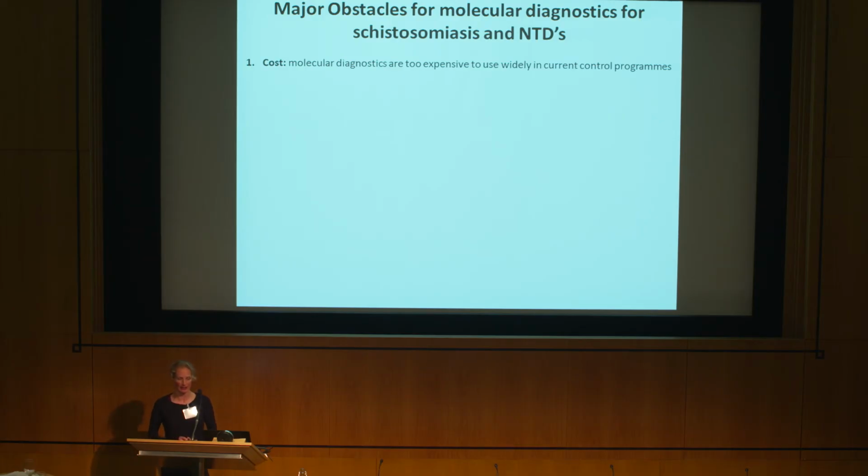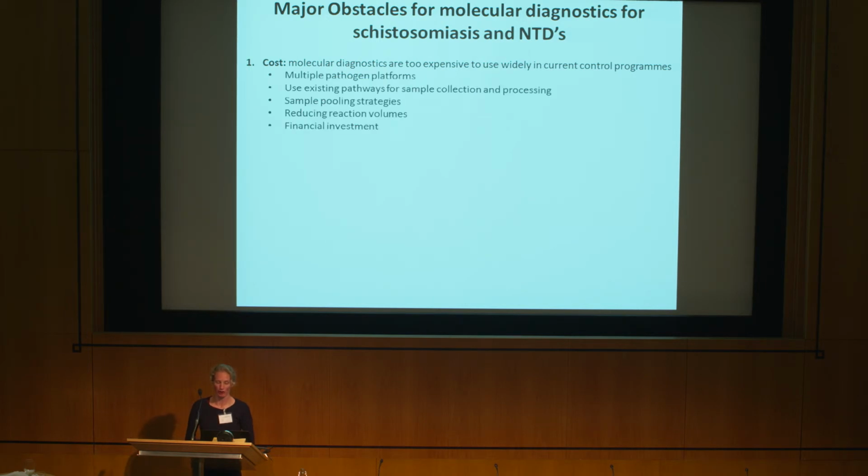So now just to move back to molecular diagnostics for schistosomiasis and also ISNTD, just to really highlight those major obstacles. So it's cost. And particularly for the RPA, they are costly. And again, too costly at the moment to incorporate into major control programs.